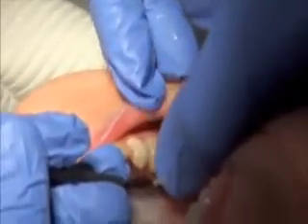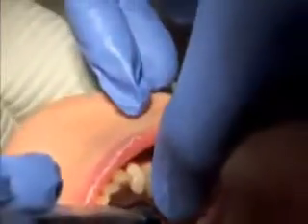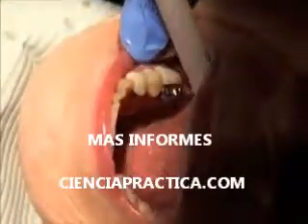Thirty minutes later, the tooth is now tooth colored and ready to bond in the mouth. Notice the use of the isolation mechanism again, which helps to ensure an excellent bond between the porcelain crown and the remaining natural tooth structure. Isolation protocols are paramount to ensure successful CAD/CAM outcomes. The finished permanent crown is completed the same day with a better seal and no temporaries.